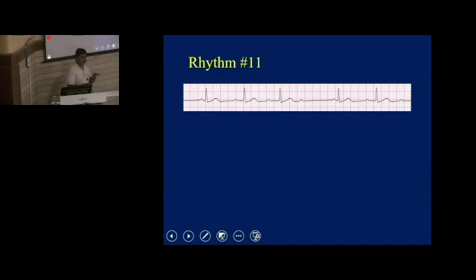Now again coming to the intervals. What about the interval? What is the finding here? Let us start from first. This one is normal. This PR interval is normal. This is prolonged. How many squares? Say about 7 squares. About? How much is this? About 10. Ab dekh rahe ho? So this is normal. This is prolonged. This is further prolonged.